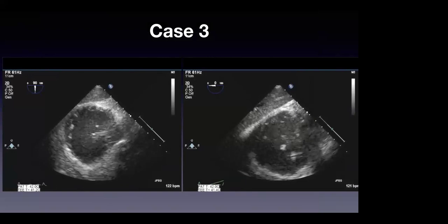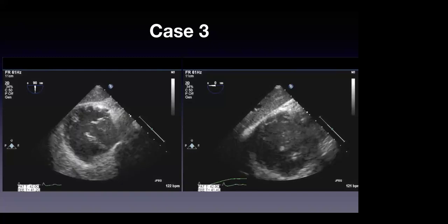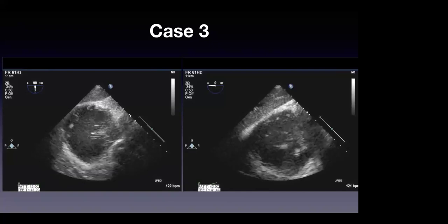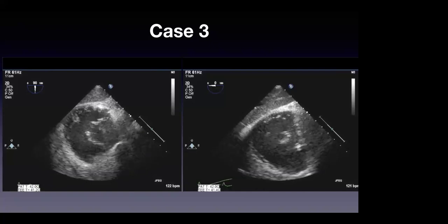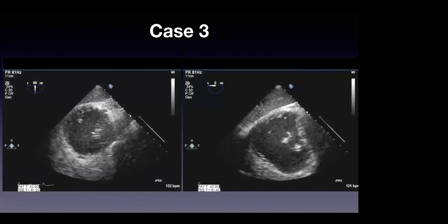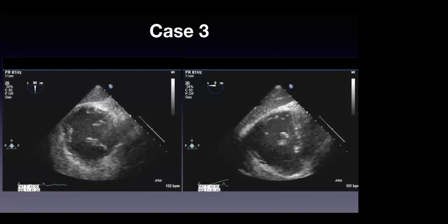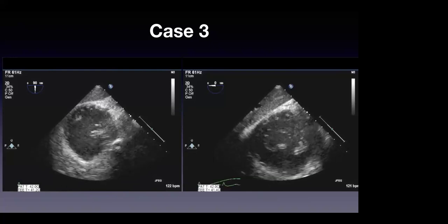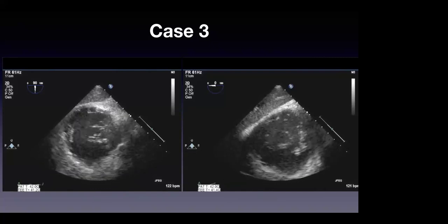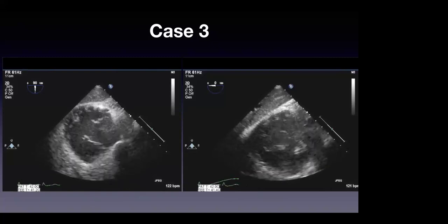So what's the diagnosis here in this trauma patient? This is what we get asked a lot actually when we do echoes on trauma patients, to rule out, because the troponin's been elevated, RV infarction, MI. What's traumatic injury causing elevated troponin and hypokinesis? Could it be a dissection of the coronary artery? That could be true, yeah, but the more common one's a contusion. Contusion is the classic term, so RV contusion.